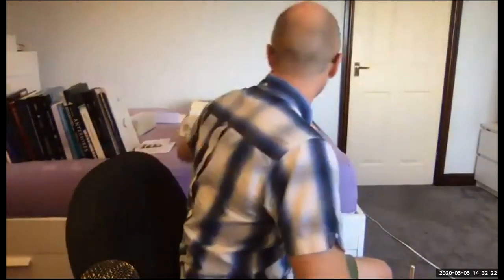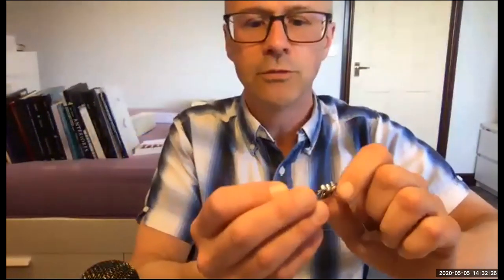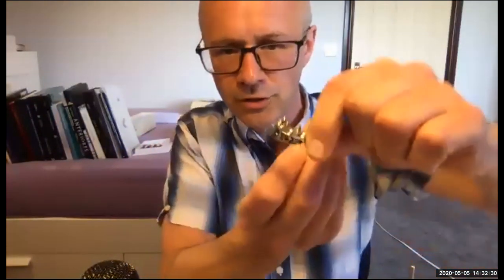Tahid Hamid asks, "Hi Finlay, can I ask, are you happy to have a cantilever on an upper bar in the maxilla?" Well, yes, I am, if it was supported properly, but it failed, didn't it? But if you look at a lot of John Coyce's work and how he recommends all-on-sixes should be with a bar sleeve system, they like to have all the implants at the back. I've got one here actually that Ruth Burke showed me. So this is the system that John Coyce really loves.